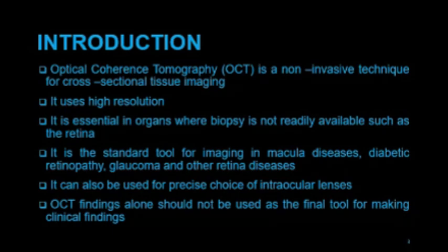It can also be used for precise choice of intraocular lenses, but that will not be my focus for today. Today, I just want us to be able to get what it is all about and how it is interpreted. And then finally, OCT findings alone should not be used as the final tool for clinical findings because it gives you a better edge when you bring in your CVF, your fundus camera, and all that stuff.